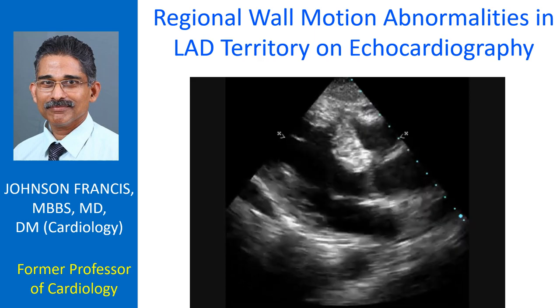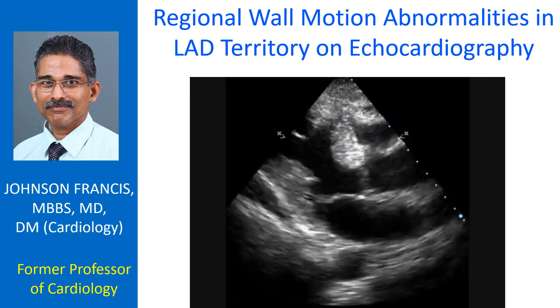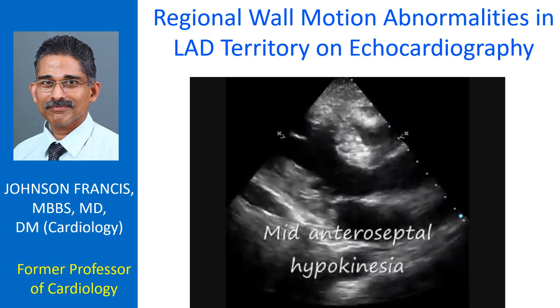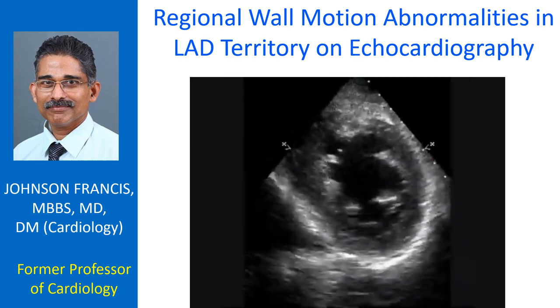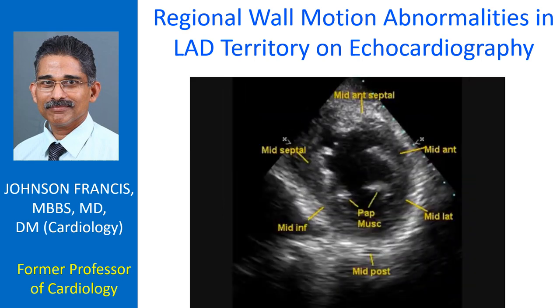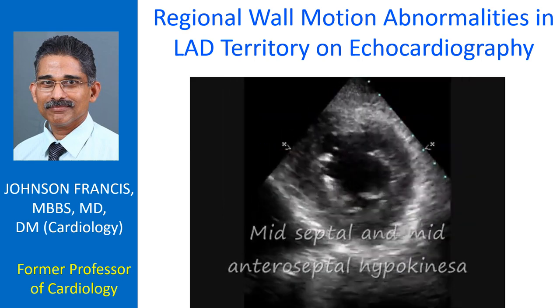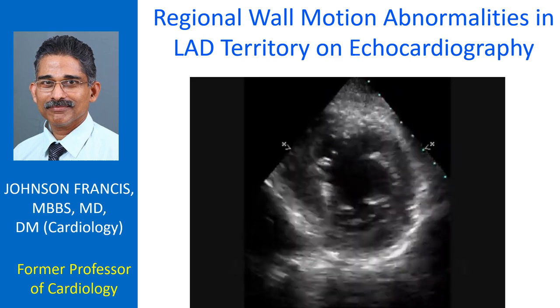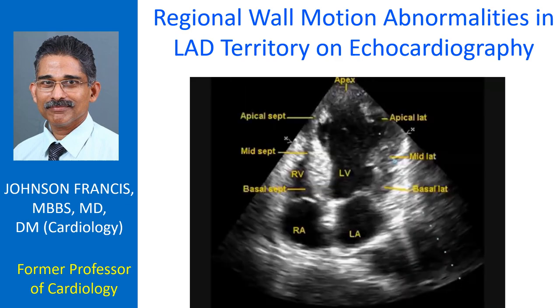2-dimensional echocardiogram in parasternal long axis, parasternal short axis, and apical four chamber views showing regional wall motion abnormalities in left anterior descending coronary artery territory.